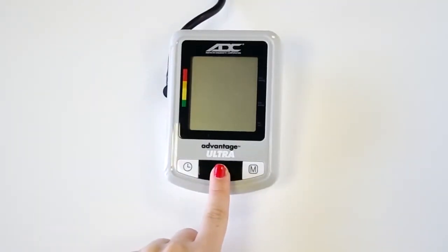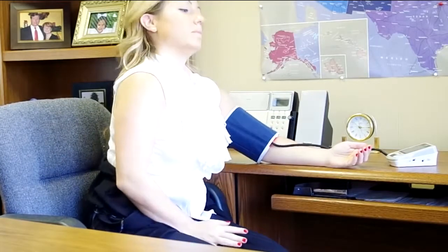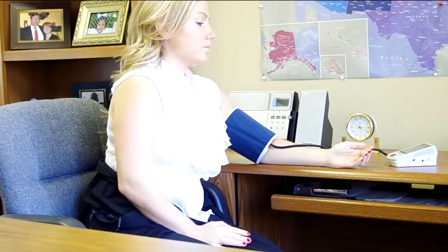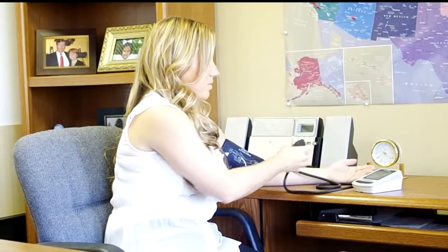To begin the measurement, press the power button. For automatic models, the cuff inflates on its own with the push of a button. If you have ADC's semi-automatic model, you will need to press the on-off button and then pump the bulb with your other hand to begin the measurement. All models will deflate and take a reading automatically.